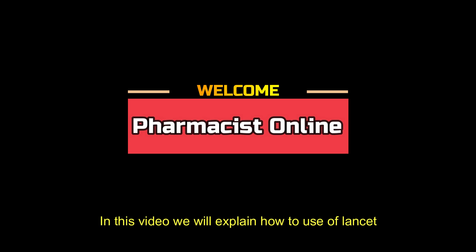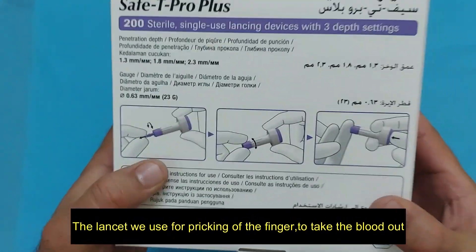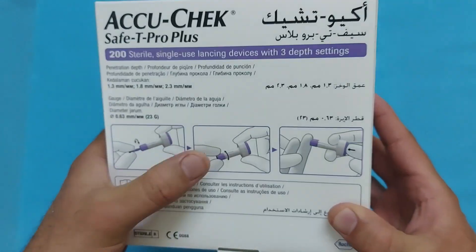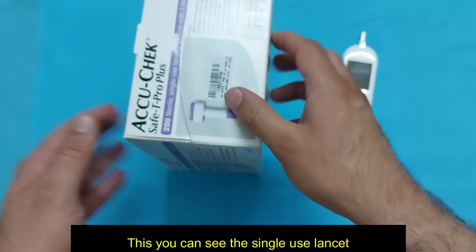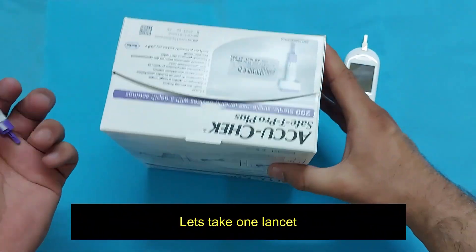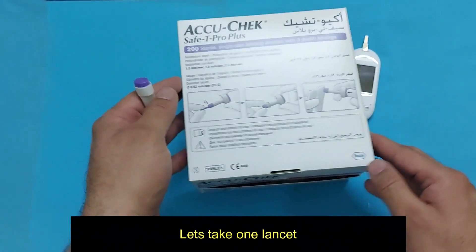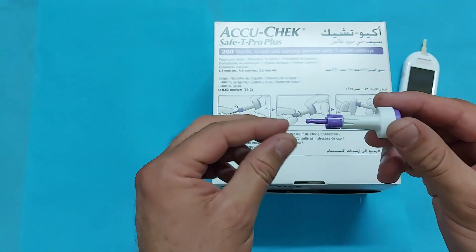Hello viewers, welcome to The Pharmacist Online. In this video we will explain how to use a lancet. The lancet is used for pricking the finger to take blood out for blood sugar testing. Here you can see the single-use lancet. Let us take one lancet and look carefully at how to open it.